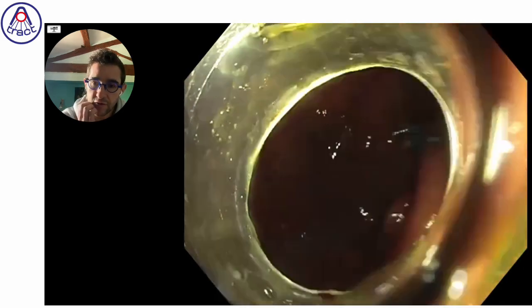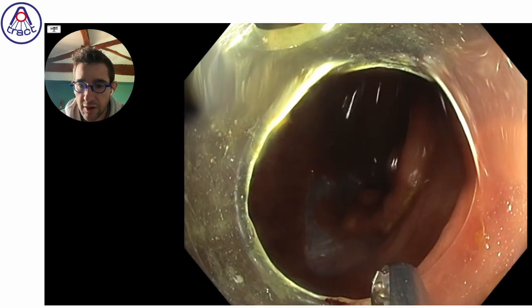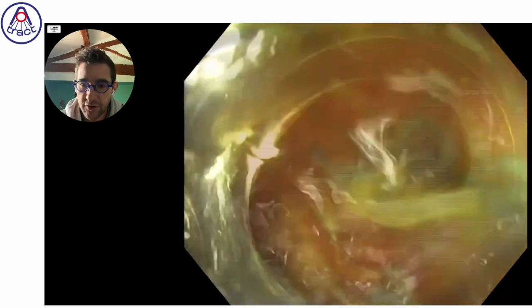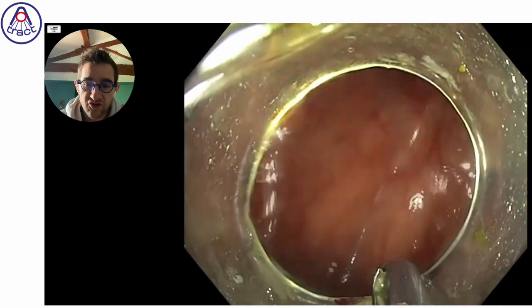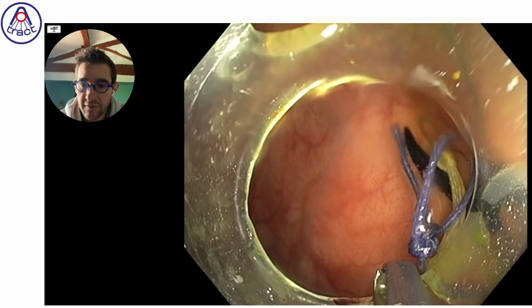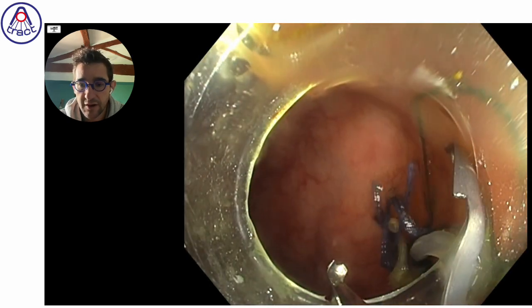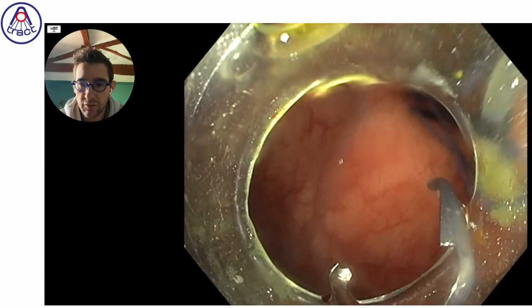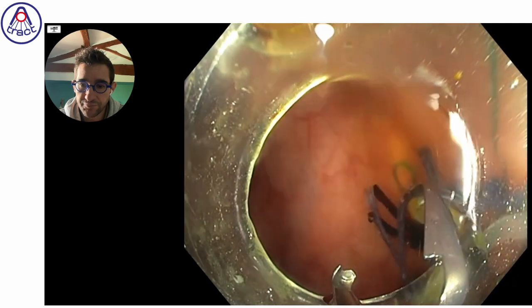As you know, in a recent prospective evaluation with this device, we reached a speed of 60 square millimeters per minute on 50 procedures, which is really very high, but it's impossible, I think, to reproduce this kind of speed without a left hand that helps the dissection, that helps you to make better exposure.